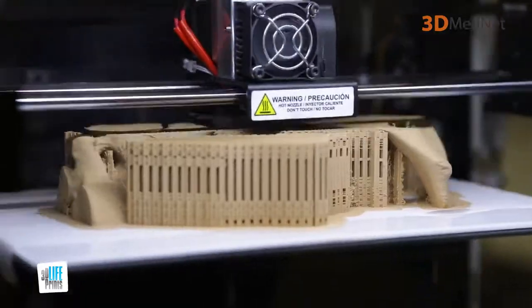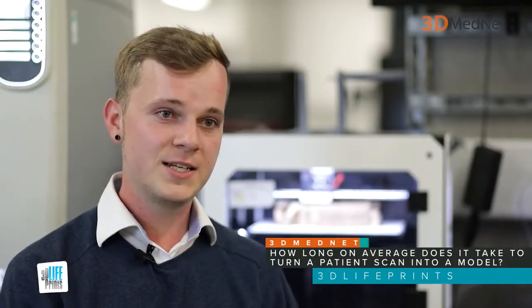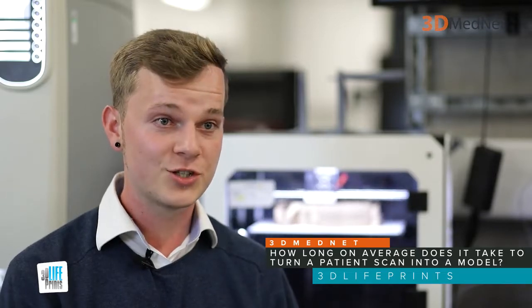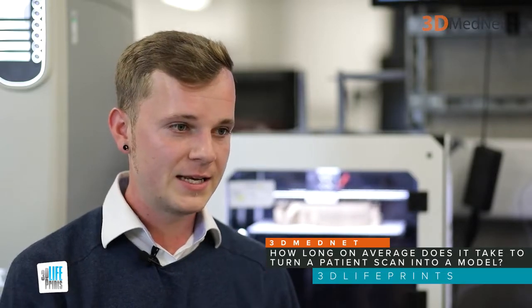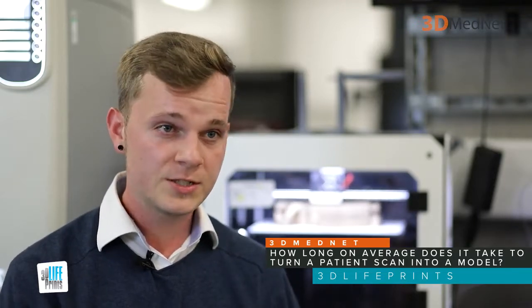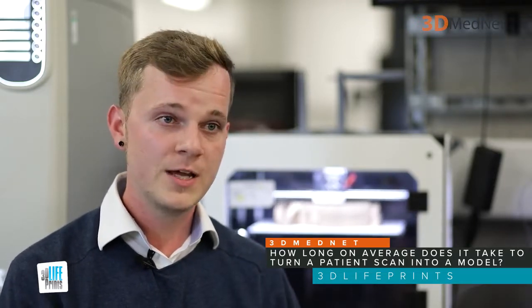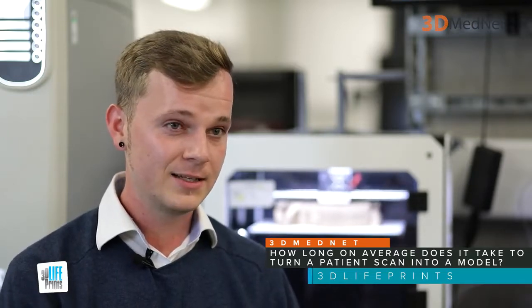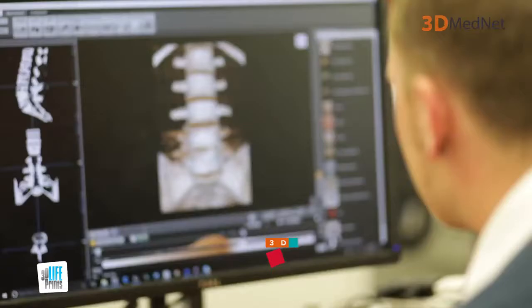Well, on average, I would say maybe half a day, 3 to 4 hours of human time spent with the software, getting the scans to a point where they are ready then to either be 3D printed or to be reviewed with the team. In cases where the imaging isn't exactly ideal, this can go on to a day or even several days.